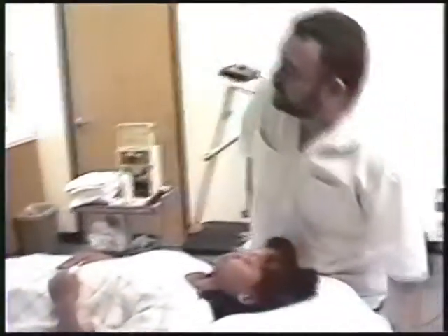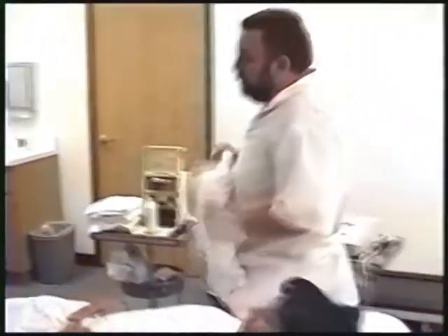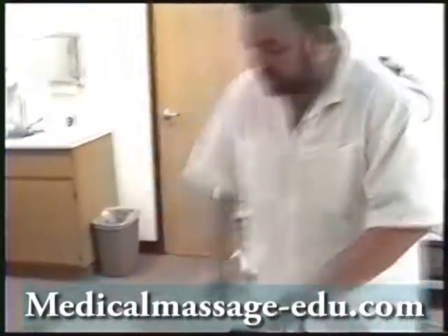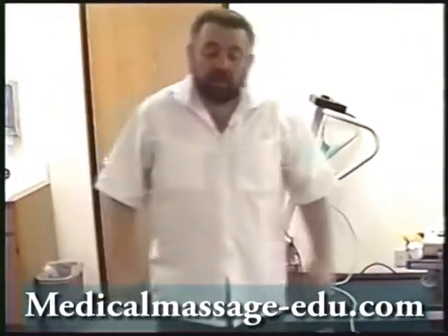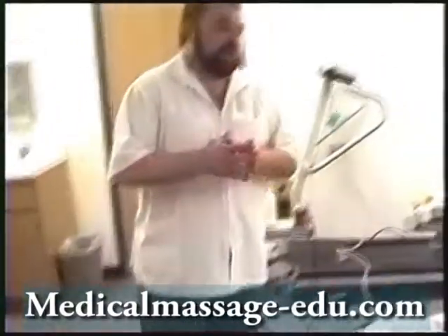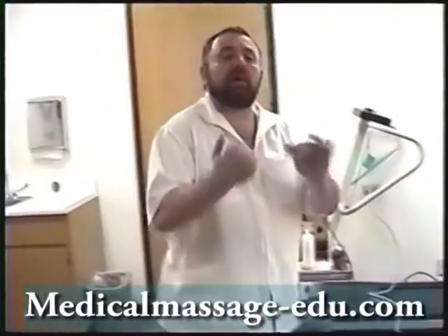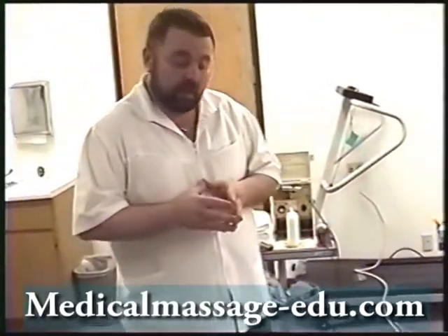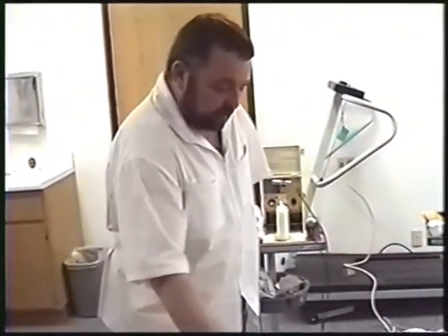I will demonstrate for you all possible modalities. Usually between 4 to 5 modalities are performed, such as massage, ultrasound, ice massage, electrical procedures, interferential, etc. This is between 3 to 5 modalities depending on the treatment plan. Today I will demonstrate as many modalities as possible.